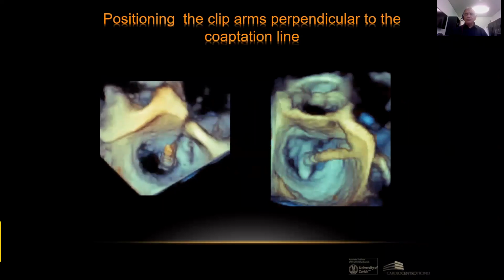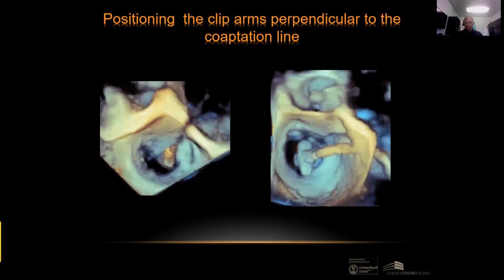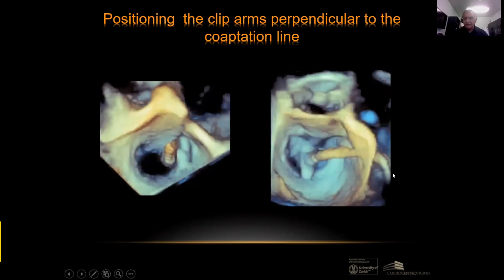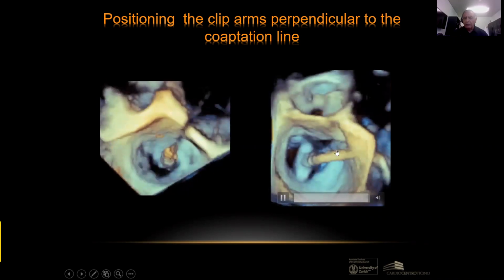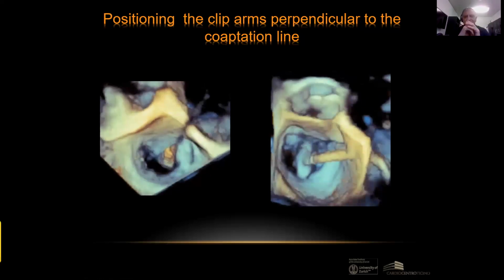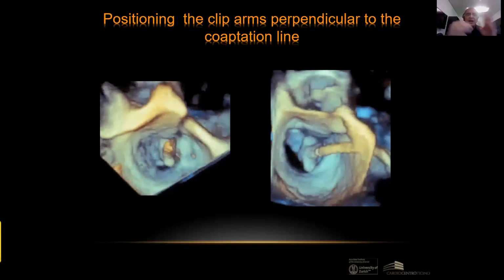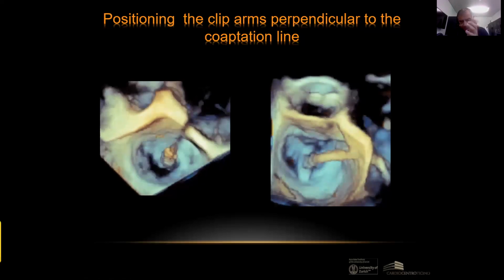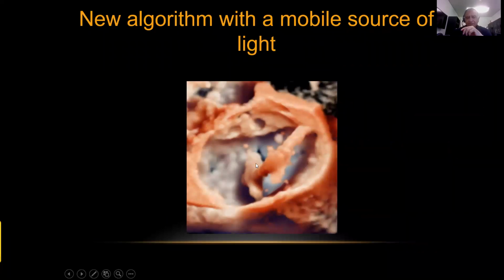And of course, if you show 3D images, they say, oh, come on, this is better than 2D transgastric view. Of course it's better. You can see the catheter from the right atrium crossing the septum and going down, and the arms positioned perpendicularly to the coaptation line. Until this moment, the proctor did not say anything, and my interventionalist anytime says, oh, give me 3D echo for the position of the arms in the left atrium. And this is another image that I showed you, showing the same images with a different source of light.